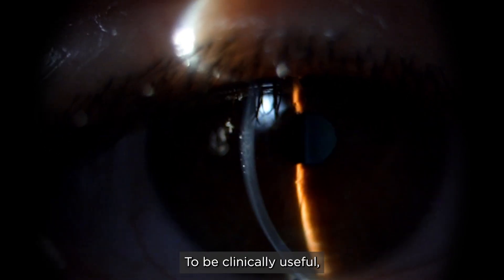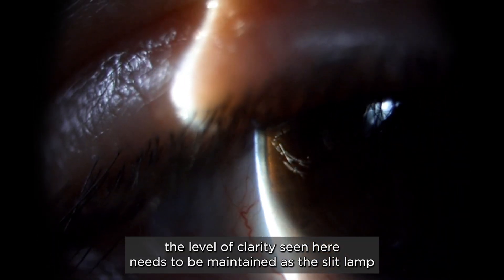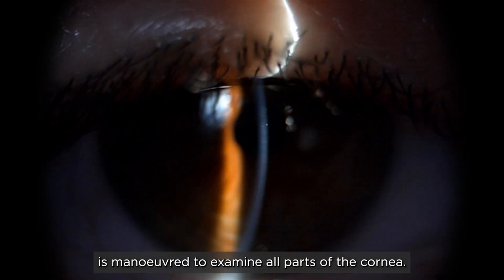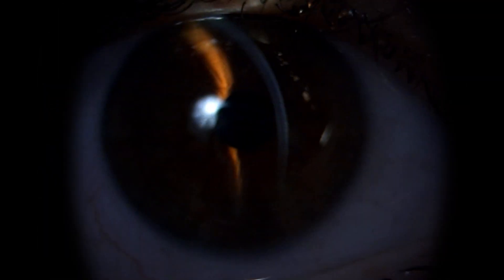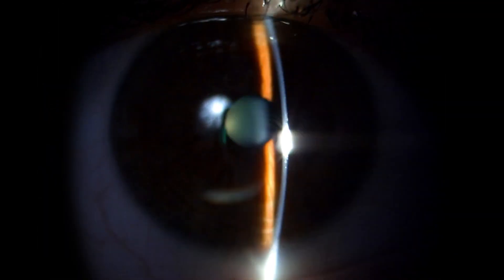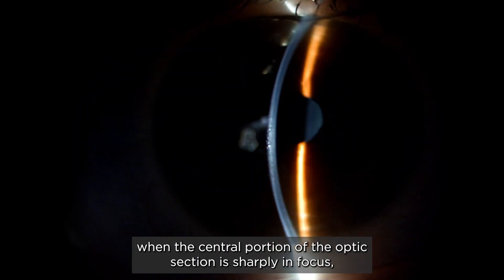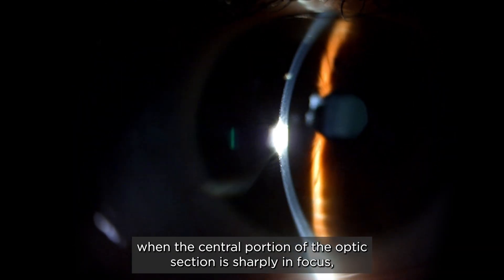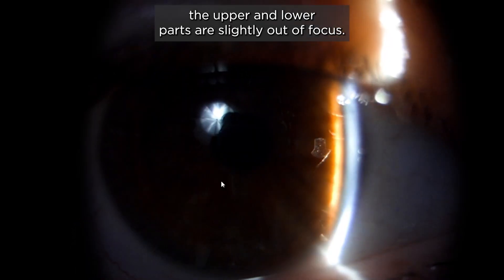To be clinically useful, the level of clarity seen here needs to be maintained as the slit lamp is maneuvered to examine all parts of the cornea. Notice that because of the curvature of the cornea, when the central portion of the optic section is sharply in focus, the upper and lower parts are slightly out of focus.